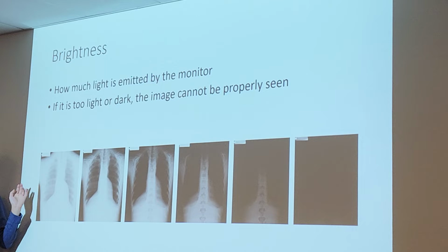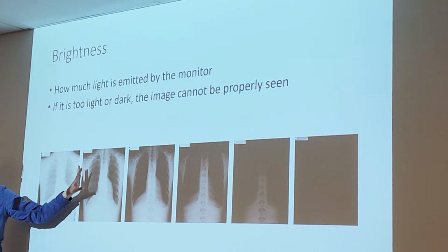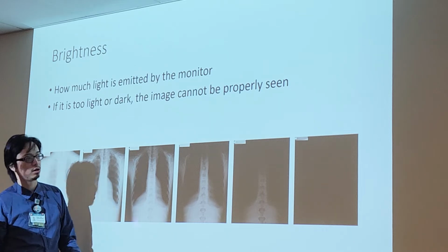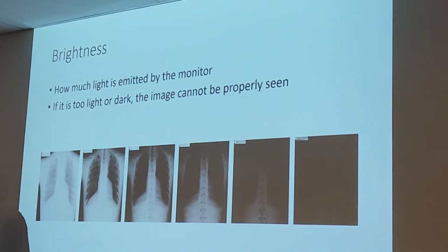Right? Not talking about lungs being black and bones being white, because that's contrast. But we're just talking about the whole image is either too bright or the whole image is too dark. Right? That is brightness.